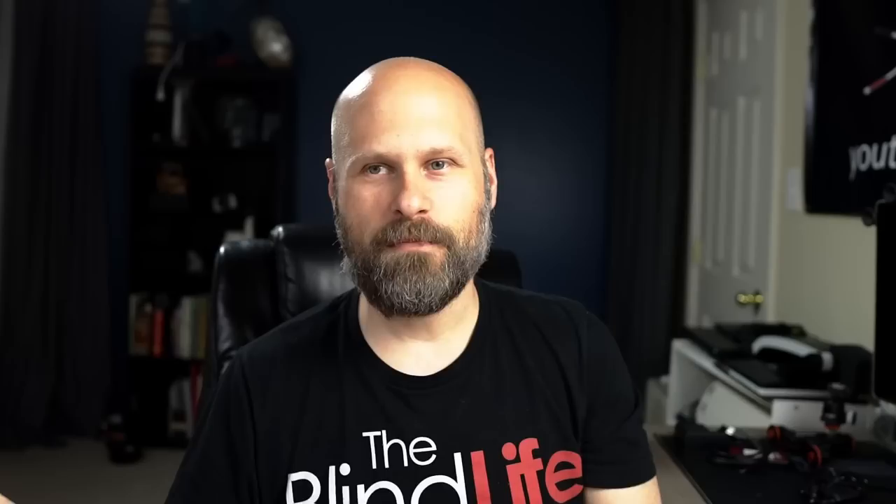This is the brand new OrCam Read. It's the newest hardware brought to us by OrCam. OrCam, if you are not familiar, makes devices that you can use to access printed material. These devices are used by anyone with some sort of reading impairment, whether that is a visual impairment, cognitive impairment, maybe dyslexia. Anybody who needs a little help reading printed material, they can use OrCam.